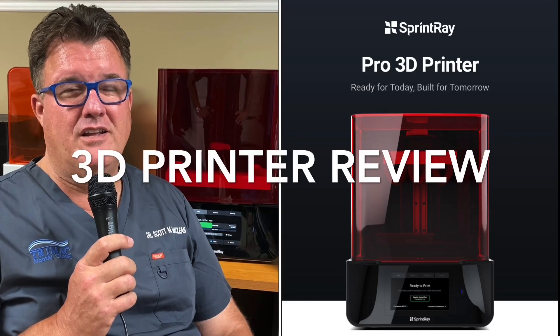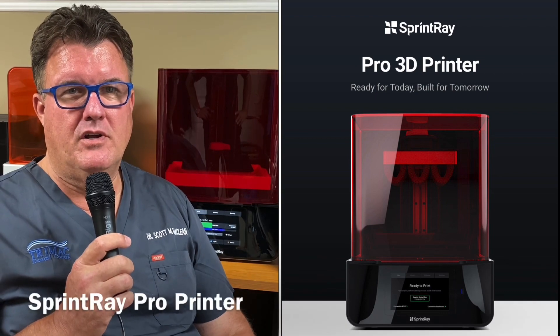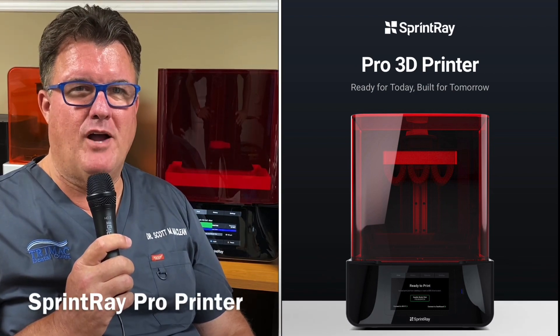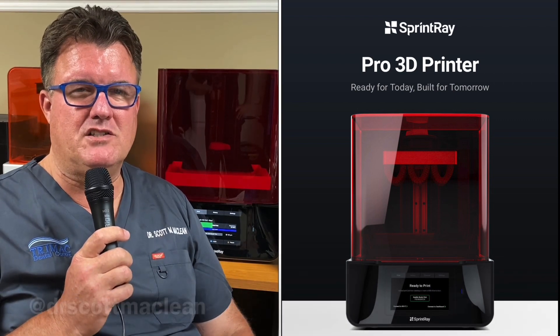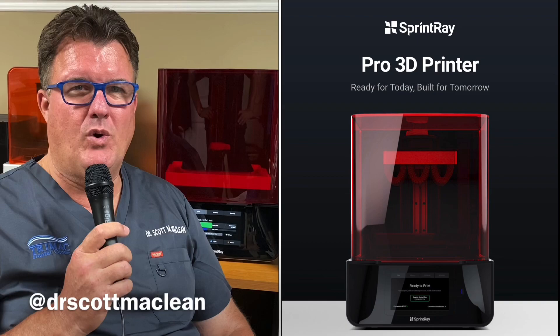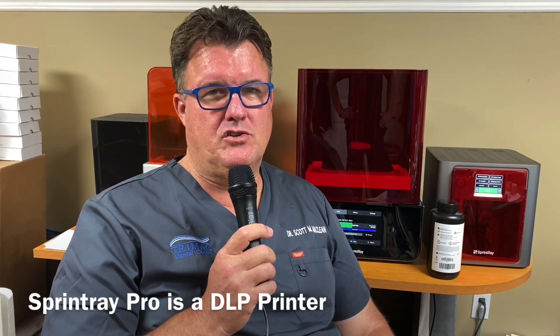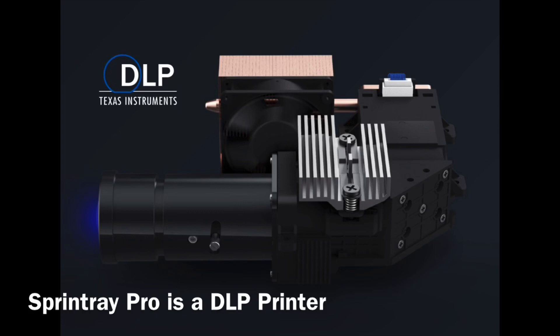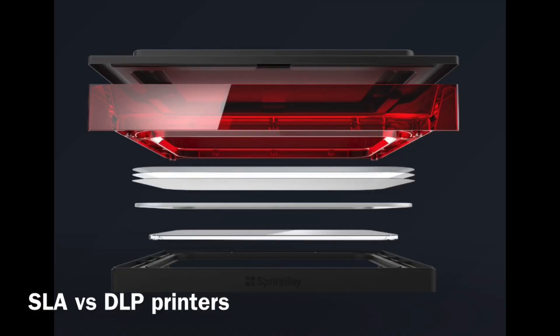Hi, it's Dr. Scott McLean and I'm doing a review of the Sprintray Pro printer - it's doing a little print job behind me right now. We're evaluating this printer we just purchased. It's a DLP printer, so there are two different types we've been using: the SLA and now the DLP. The SLA prints kind of like tracing around, where the DLP is more of a stamp-light printer - a digital light projection type of imaging.